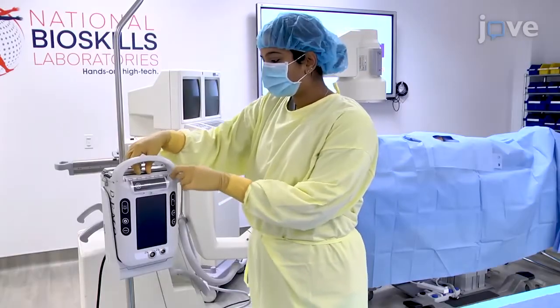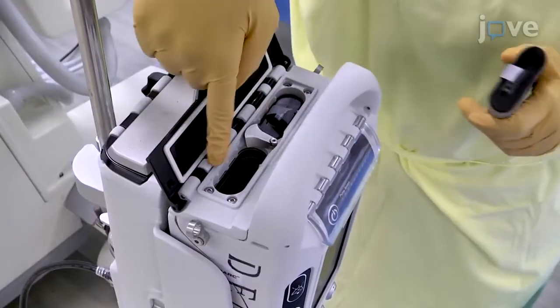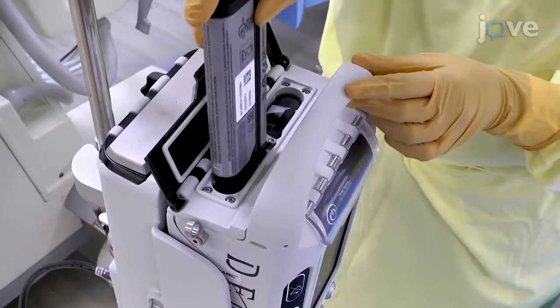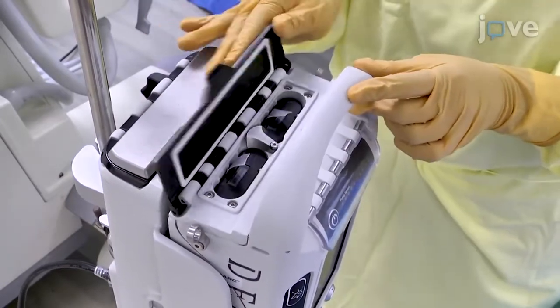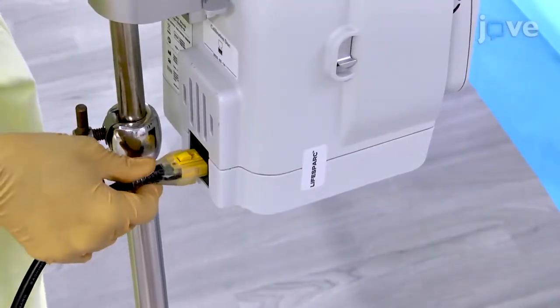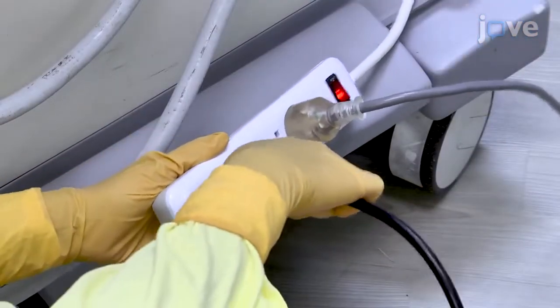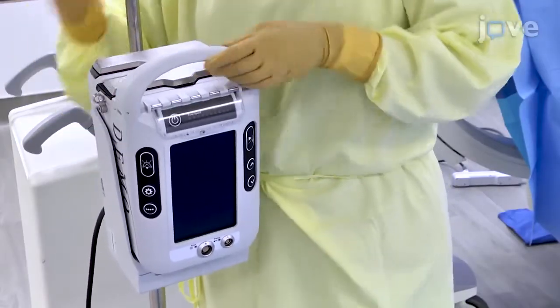To set up the controller, begin by opening the box of the device and access the battery door to place the batteries, two at a time, in the controller with the logo facing away from the controller screen. The batteries should be well seated with the groove on the battery aligning with the key battery housing. After placing the four batteries, attach the controller to the dock, ensuring it is fully seated. Then connect the power cord to the power outlet of the controller and plug in the other end to the wall socket for AC power.